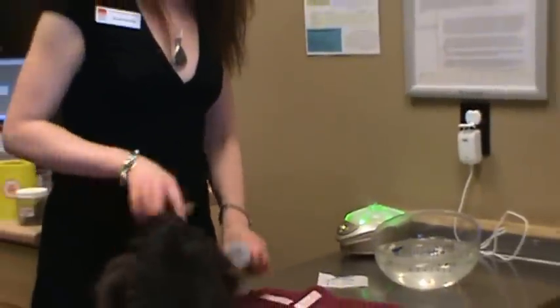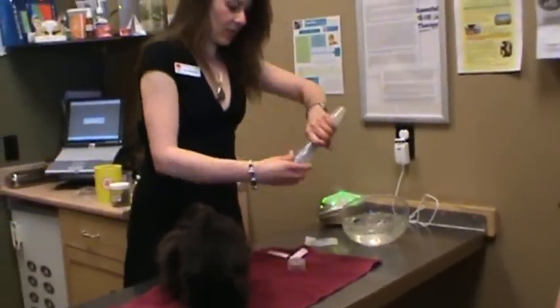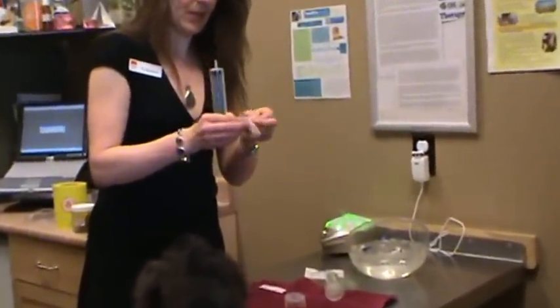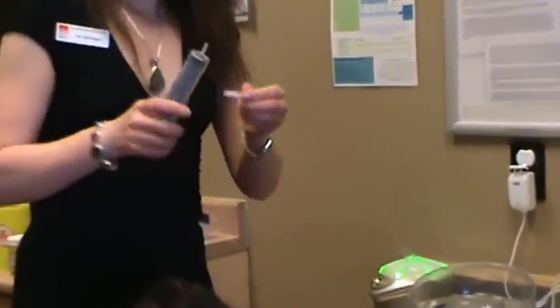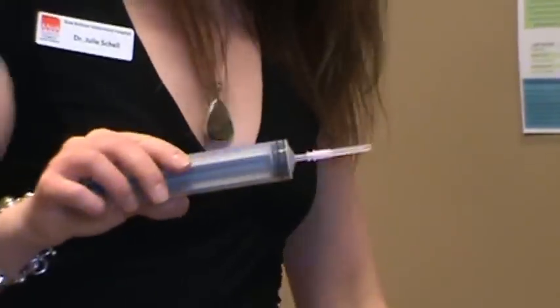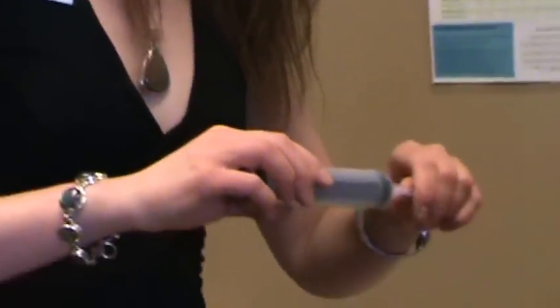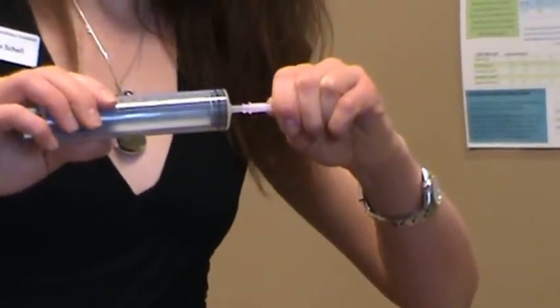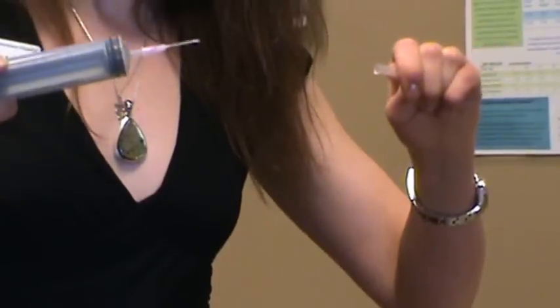We never want to make the cat feel cold. Often these kidney cats, or any cat that needs fluids, is a little bit deficient. So we open up the syringe and we try to do this as sterile as possible, and we put the needle on right like this. You take it out of the syringe and put the needle right on.